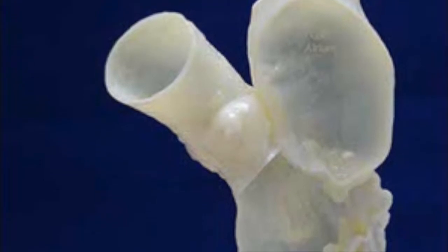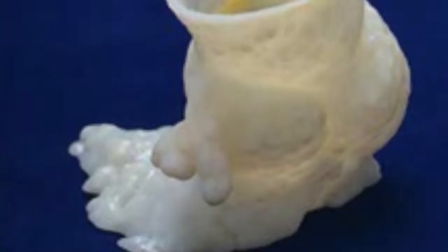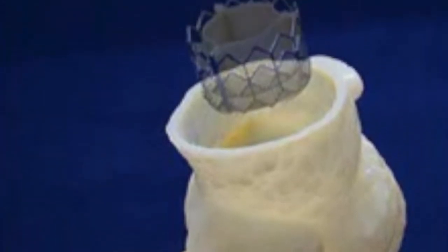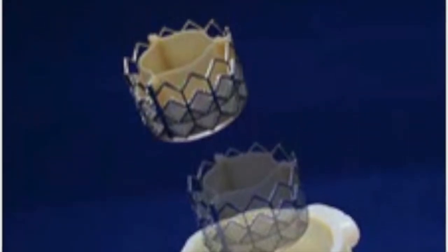And with 3D printing, what are some examples that you've had at your facilities so far that have helped answer some of these clinical questions? We've implemented 3D printing in our complex structural heart interventions, transcatheter mitral valve replacements specifically, so that we can get a better view of their anatomy and how it integrates with other parts of the structure. As a clinician in cardiology, we want to see the interplay between different parts of the body. And with this modeling, we can get a whole perspective instead of a static image that we see in a 3D viewer. These are non-surgical candidates, so everything we do is through a catheter that goes from the patient's groin up to their heart. We do a lot of this on these patients.